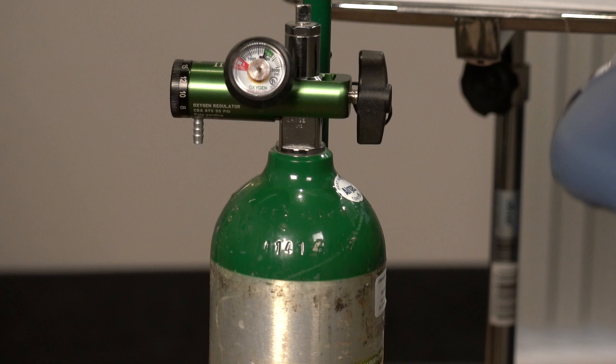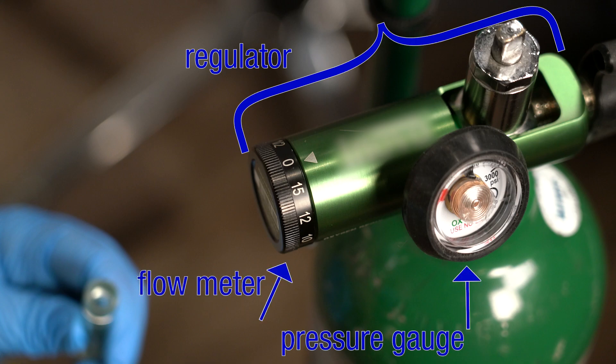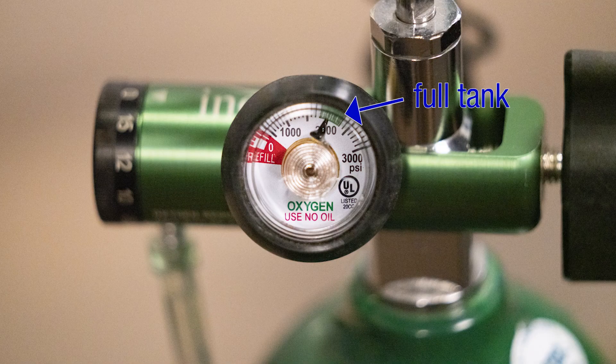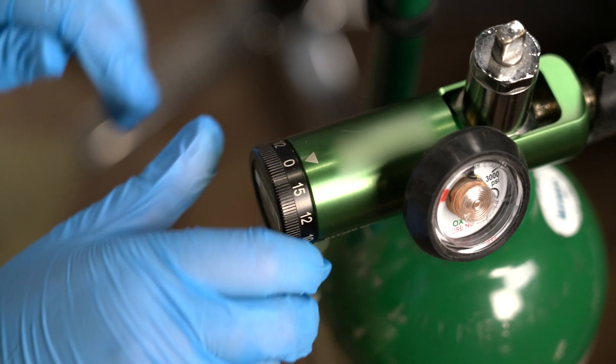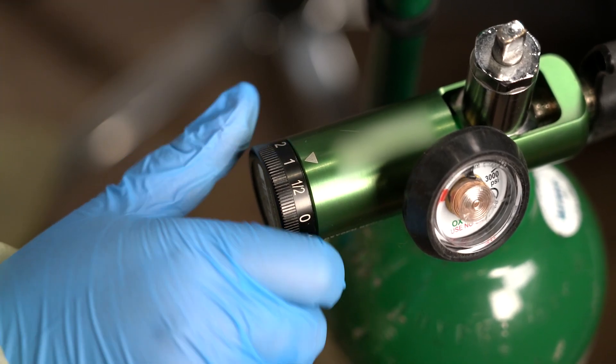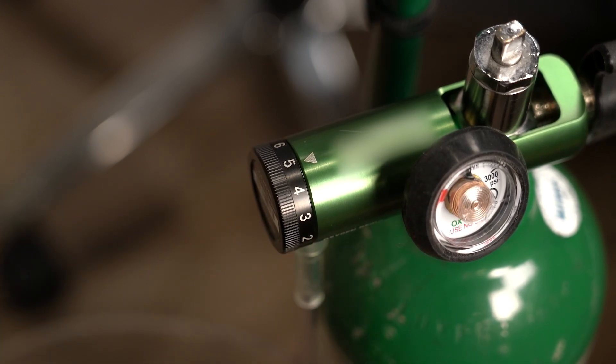Oxygen therapy can be given using an oxygen tank. Oxygen tanks have a regulator, which includes a pressure gauge and a flow meter. The regulator limits the pressure of oxygen that's released. The pressure gauge shows the amount of oxygen in the tank. If the needle on the gauge is in the red zone, the tank is nearly empty. The flow meter controls the oxygen flow to the patient. It shows you how much oxygen, measured in liters per minute, is given to the patient when you open and close the adjustable valve.